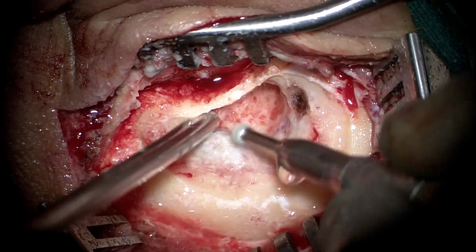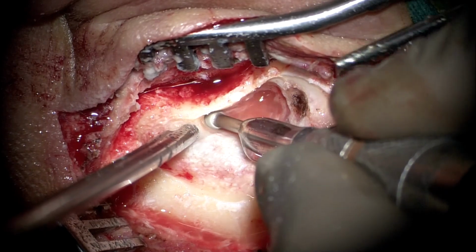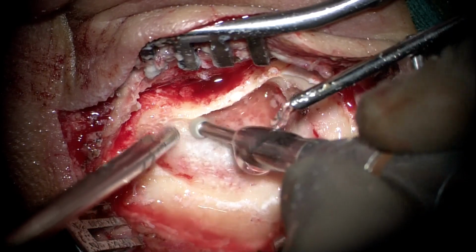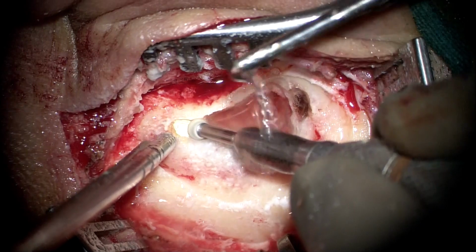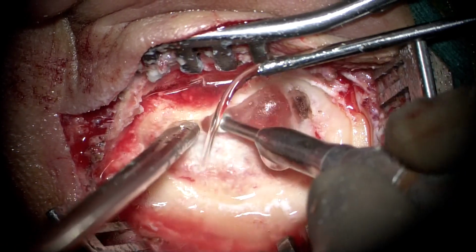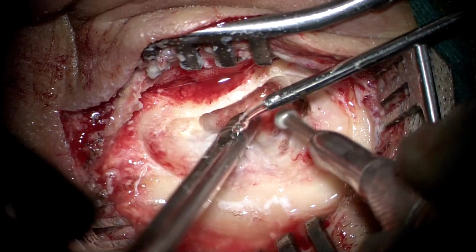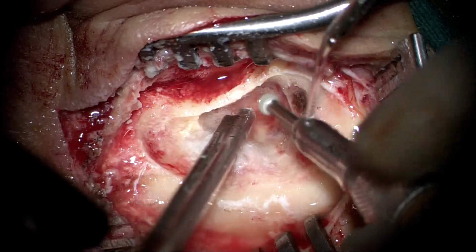So our goal here is to completely unroof the sigmoid sinus. We're not going to use any Bill's Island here because that is not enough to generate the kind of space that we desire, and we'll see that in time. So as you can see in this sclerosed mastoid, there are no cells here inferiorly. The tip is not pneumatized, and this thick block of bone has to be drilled cautiously and slowly with the right size burr to achieve the complete exposure of the sigmoid sinus from superior to inferior.